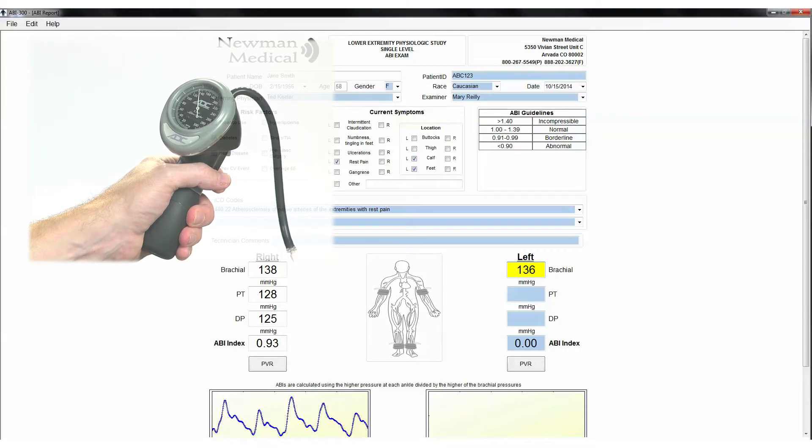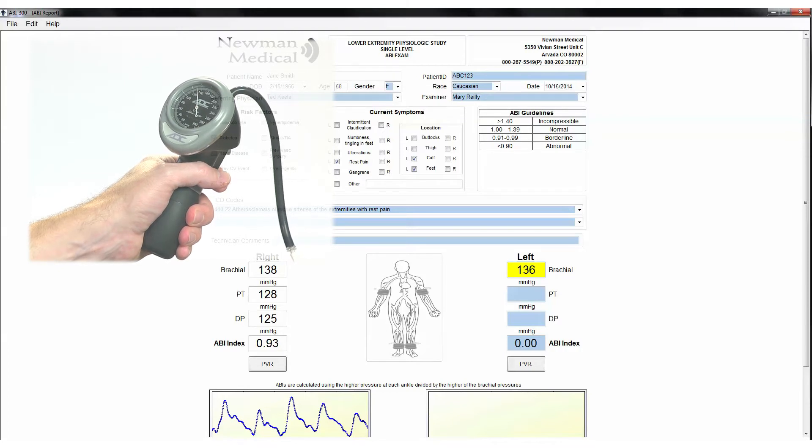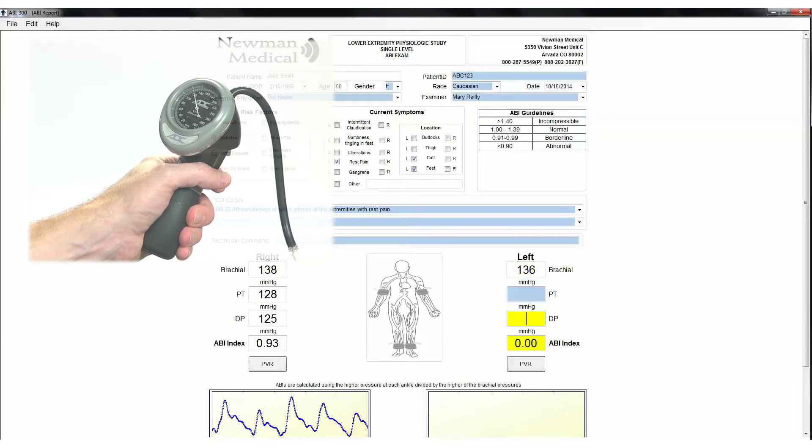Move the aneroid to the left ankle cuff and press Tab or use the cursor to move to the left DP site. Take the left DP pressure. Enter this pressure in the left DP field. Press Tab or use the cursor to move to the left PT field. Now take the left PT pressure. Enter this pressure in left PT field.